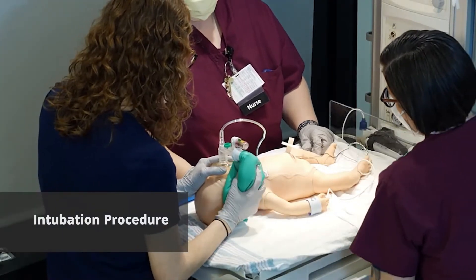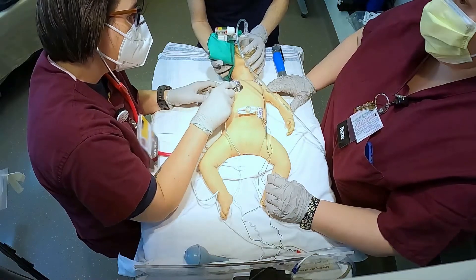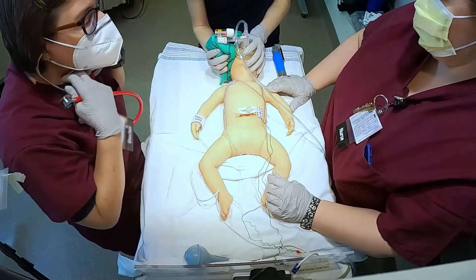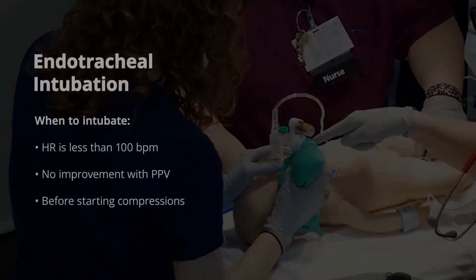We've got pretty good chest rise here. I'm going to go ahead and listen — yes, we've got air movement. The heart rate is still low, still under a hundred. Let's go ahead and prep for intubation.